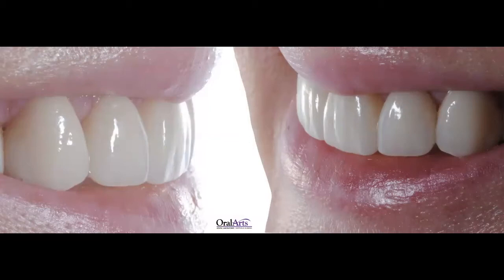And most importantly, these are cases that I've worked with. For all the cases that I'm going to share with you today, the ceramic was done by Oral Arts Dental Laboratories. And I want you to see the texture, the tertiary anatomy, the artistic hands that the lab technician needs to have to be able to add the stains, to add the white, the gray, the mamelons, all those things that are so important in aesthetic dentistry, that we definitely need to understand and to communicate to the lab and tell them this is what I'm looking for. But at the same time, choosing the right substrate.